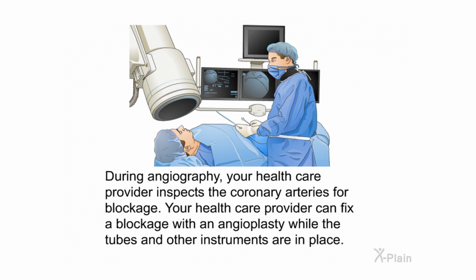During angiography, your healthcare provider inspects the coronary arteries for blockage. Your healthcare provider can fix a blockage with an angioplasty while the tubes and other instruments are in place.